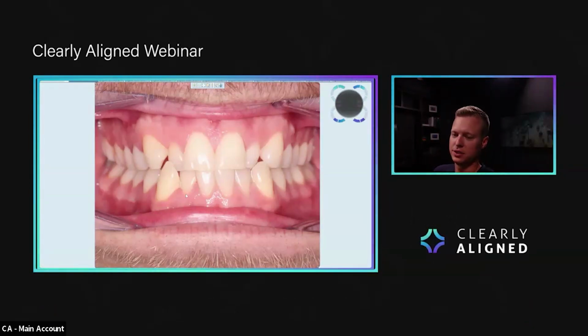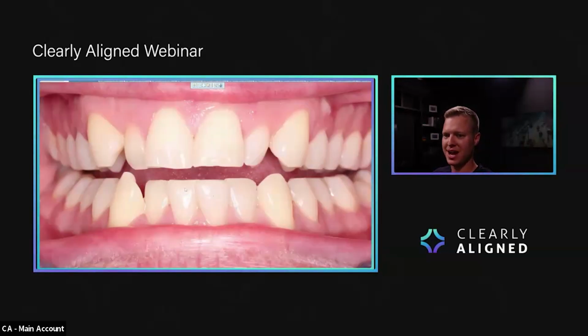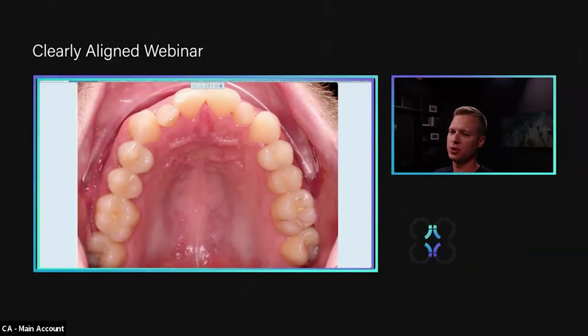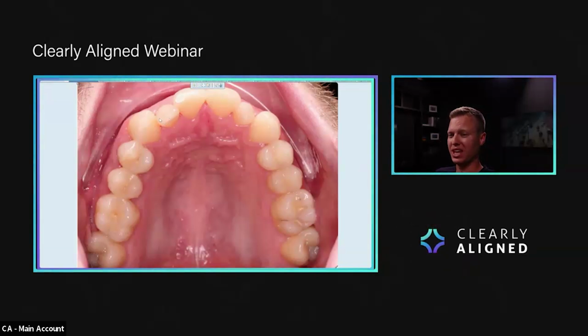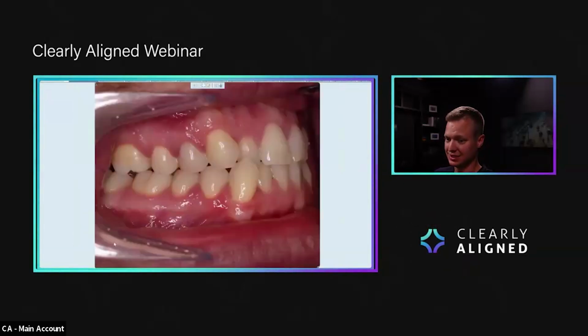Now, you guys are smart. You probably already look at this and say, look at those itty bitty lateral incisors. So if you ever see a lateral incisor that is smaller or the same size as the lower incisors, then you know you have a Bolton discrepancy. Now, in this case, because these lateral incisors are even smaller, then we know that we're probably going to have to address this, not just with doing buildups on the teeth to make them the normal size, but we even have to consider still doing IPR on the lowers because of his class 3 positioning, right?